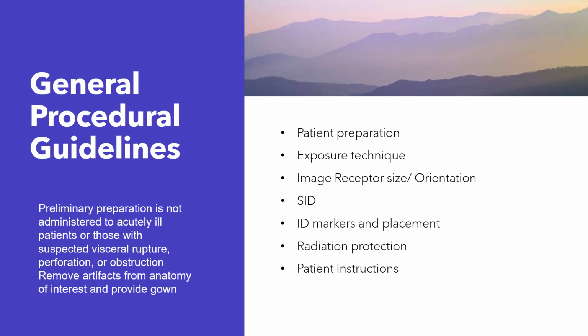Okay, you do want to provide a gown for most, have them change, and sweep for artifacts: jewelry, necklaces, belly button piercings, nipple piercings, things of that nature. Yes, we have to ask. Yes, the patient can refuse. Just make a note to the radiologist: patient refused to remove their bling, and let's get on with our day.